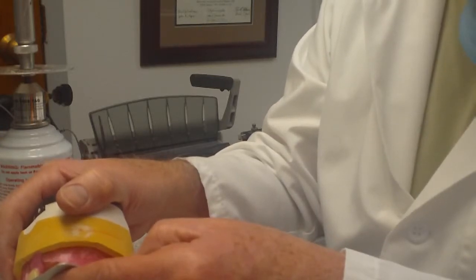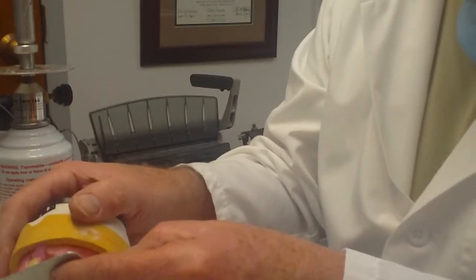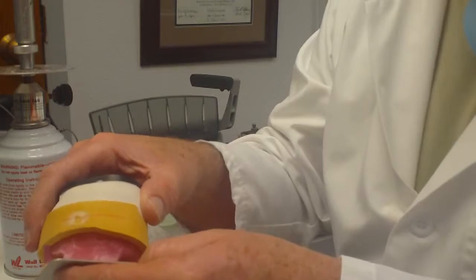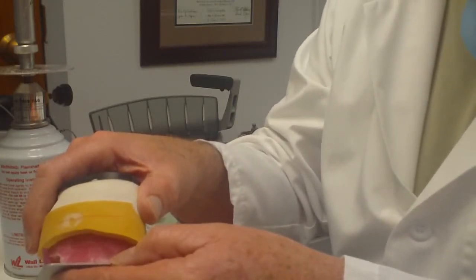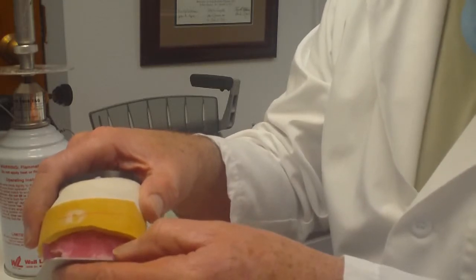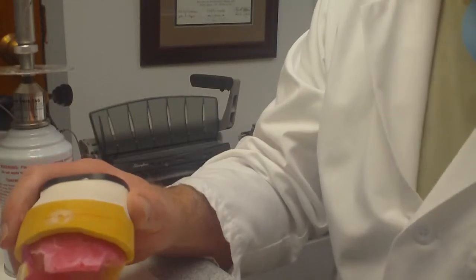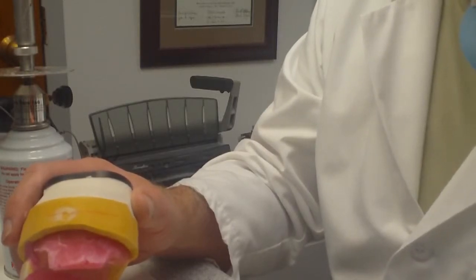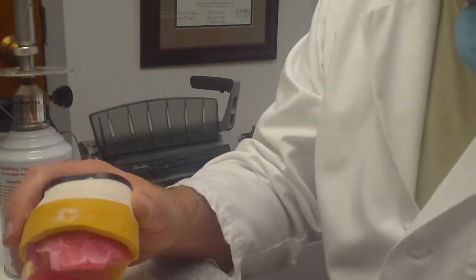And this was established by using a Fox plane. If you're not familiar with it, you can find them, and it allows us to tentatively determine the occlusal plane by paralleling it to the ala-tragus line. So that's where we are. Remember, ultimately what's going to guide the position of the posterior teeth and the occlusal plane is from the tip of the mandibular canine back to one-half to two-thirds the height of the retromolar pad. And as we get to that point, I'll try to demonstrate what I'm talking about.